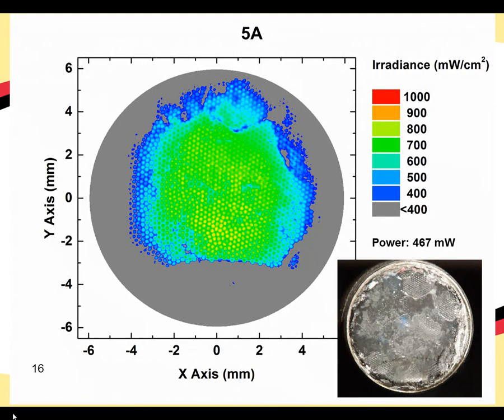Hopefully you're not using a light guide that looks like these. These light guides were being used by dental students. It's representative of the lack of use of barriers on the light guide that can cause contamination of composite getting on those light guides. Also, in some cases, the lights were dropped and the tips were damaged. In preclinical laboratories, typically barriers aren't used. But in the clinical setting, you need to use barriers over those light guide tips. You can even use saran wrap over the light guide to protect the tip from cured composite getting on that tip end.